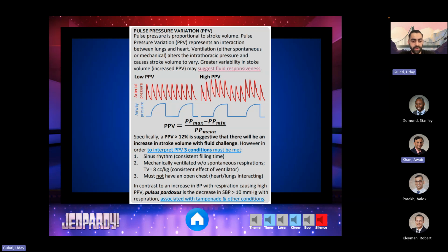The reason I throw in the passive ventilation is that's how, when we initially identified this, a lot of the studies were done. But you guys are absolutely right, if that's what I'm hearing, that you can do it in patients that are not fully passively ventilated, but you have to be on a certain amount of positive pressure.